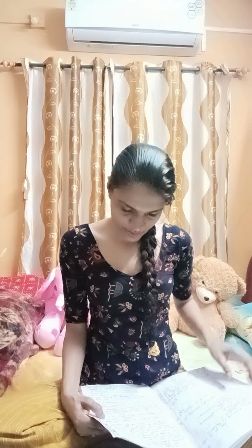So this Hess chart is based on the haploscopic principle. Now, what are the prerequisites when we want to do the Hess charting? What should the person possess? The person first should be cooperative. You cannot do the test on a child who is not cooperative. If the patient has psychiatric illness, or the person is very old and irritated, or any irritated, uncooperative patient, you cannot do this test.